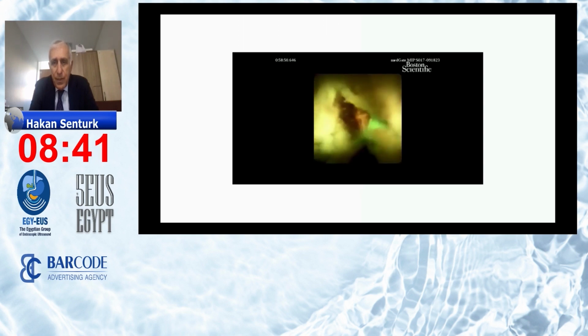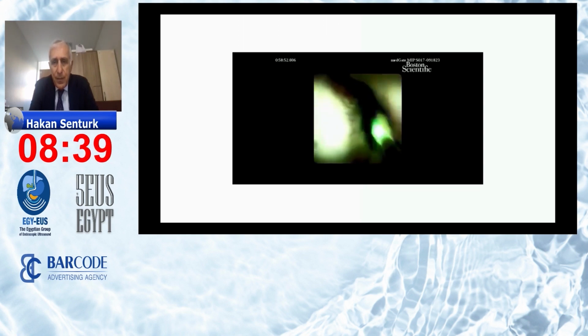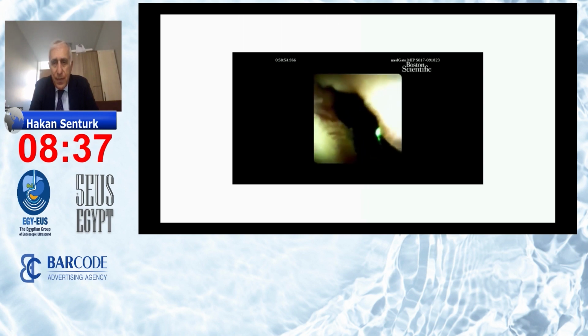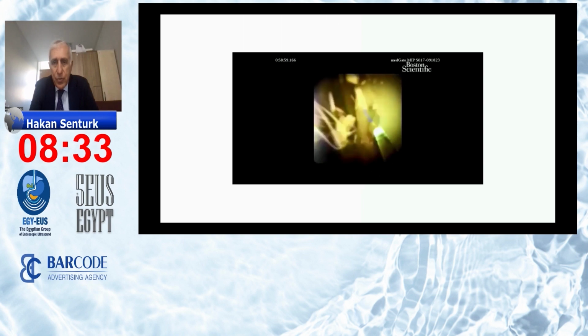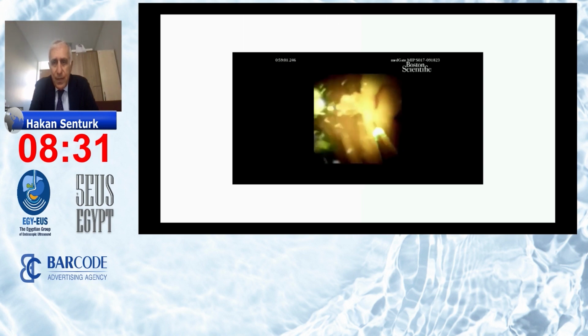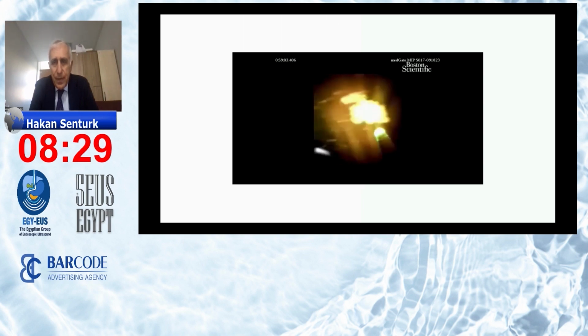And you see, we check the hepaticojejunostomy site. There is no stone anymore. This is the hepaticojejunostomy site. And now we are in jejunum. There is no obstruction. The procedure is complete.